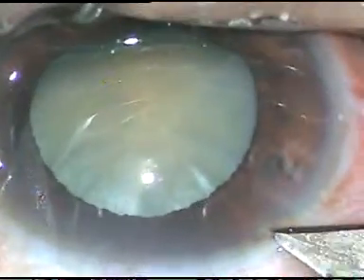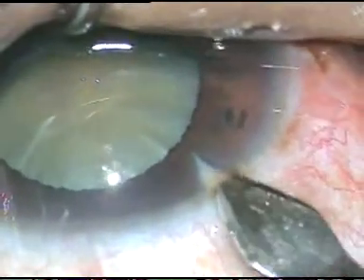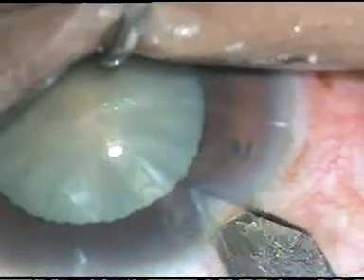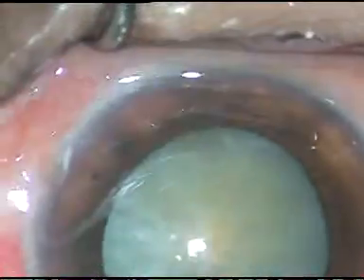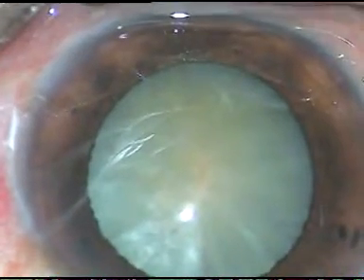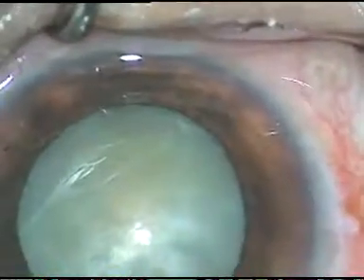Dear colleagues, this is a mature non-intumescent cataract. In this case, the rhexis ran out. Even then, I tried phacoemulsification and I was able to do the case. Let us watch the surgical steps.